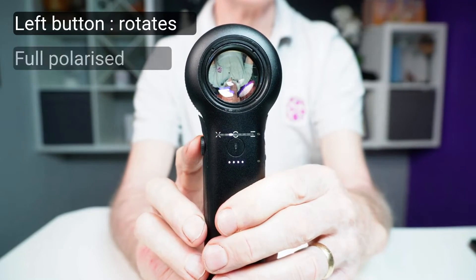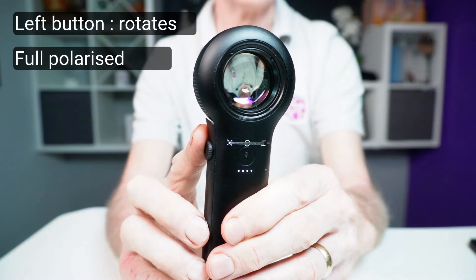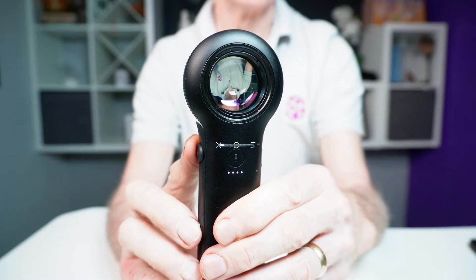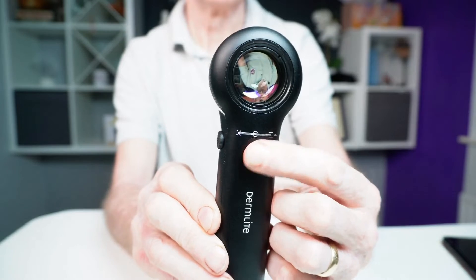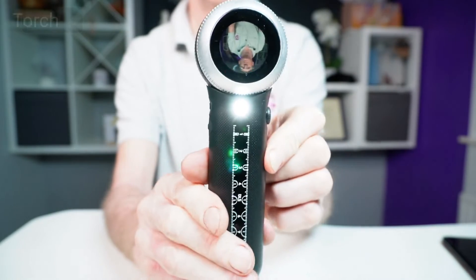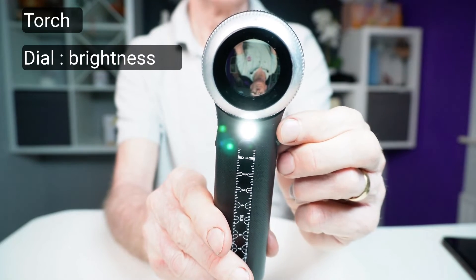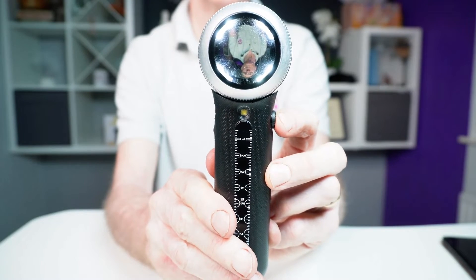This button also rotates with a slight clicking sensation forward and backwards, and when in full cross-polarisation mode, rotating the button moves you through the non-polarised light and into what's called linear or parallel polarised light. We'll explore what that means later in the Exploring Features section. A button in the centre of the handle switches on and off a simple LED light that acts as a torch. Rotation of the dial button varies the level of brightness. This is for general skin illumination only, and pressing it switches off the dermascope's main light, which can't be used at the same time.